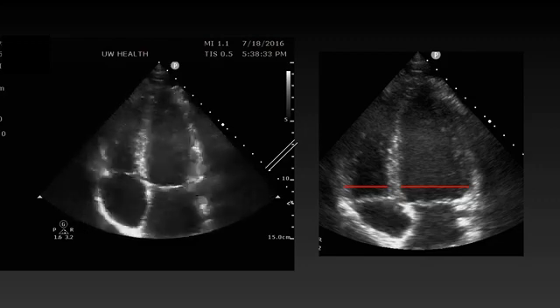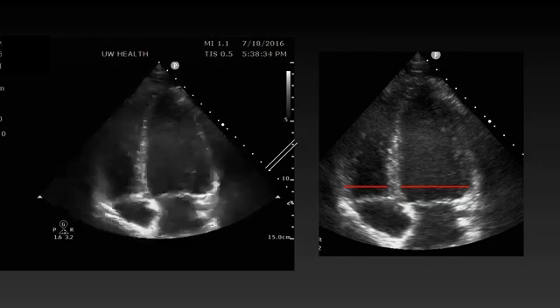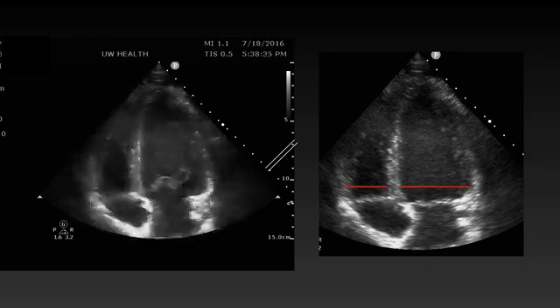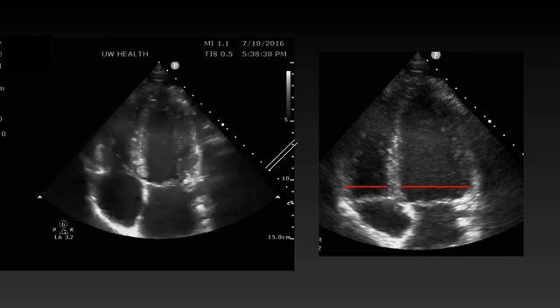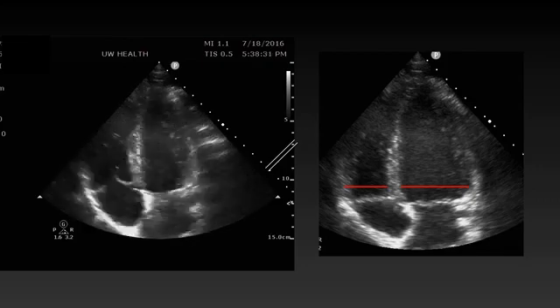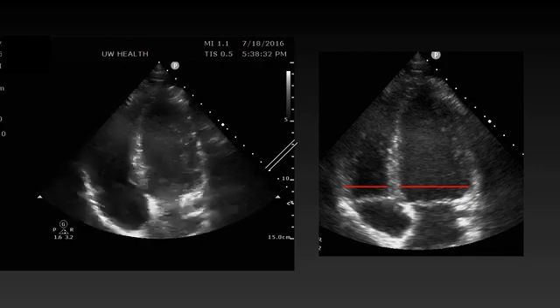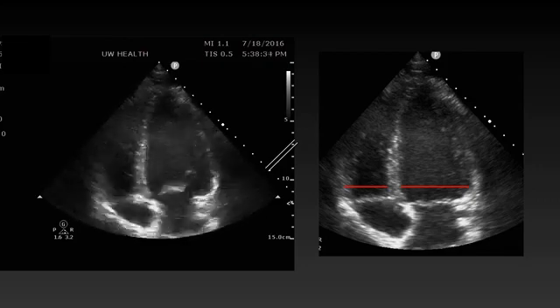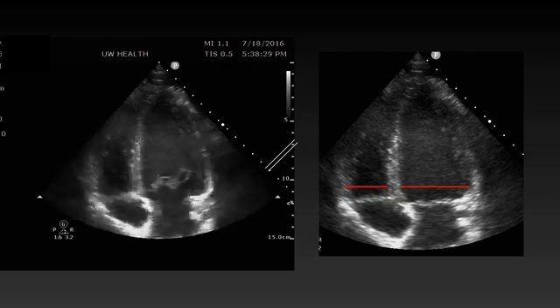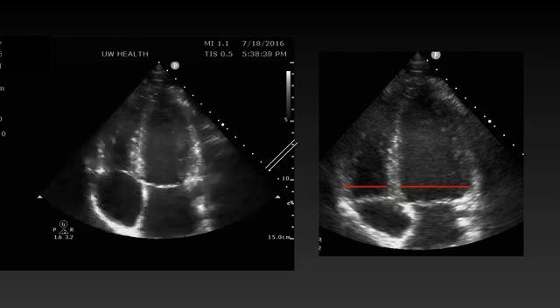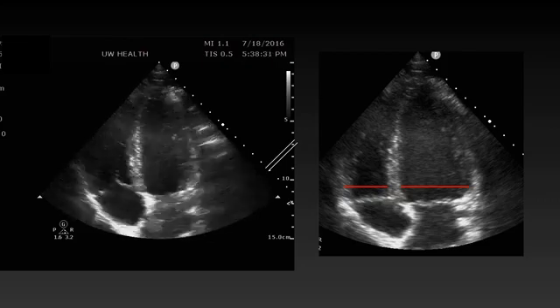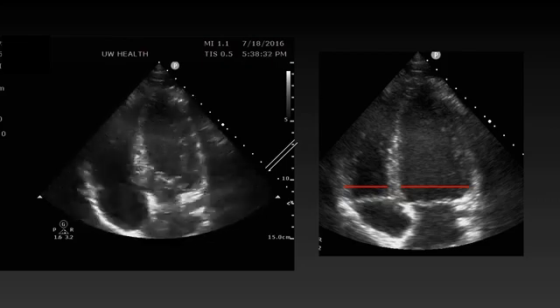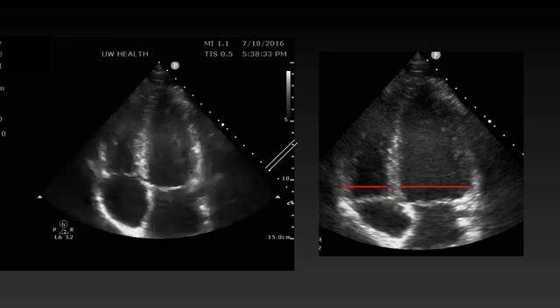The right ventricle should look like a triangle in most of the echo views and should be about one-third the size of the LV. The right ventricular free wall should move in towards the septum and longitudinally towards the apex in good function.